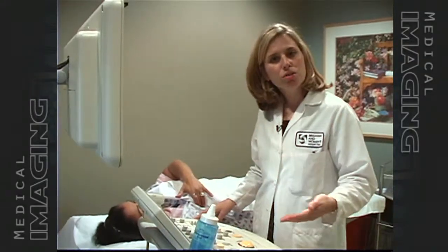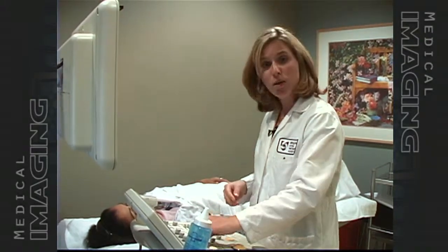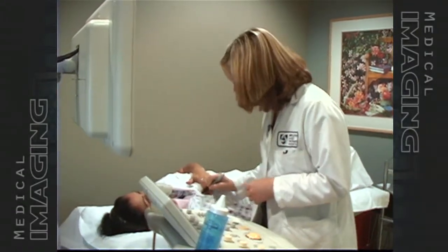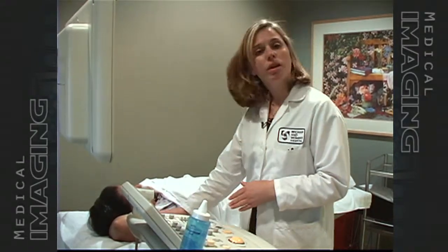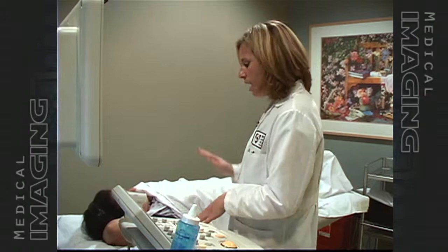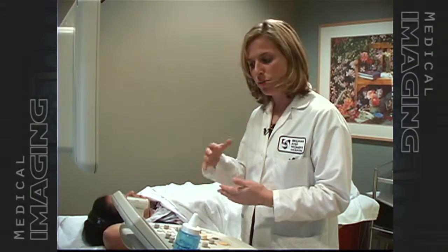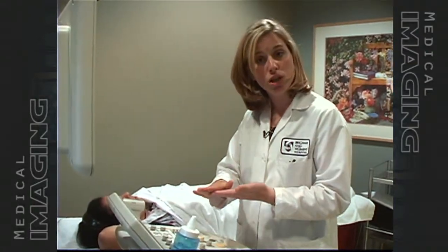The first thing we do to evaluate a lump is we have the patient show us where they're feeling the lump, or where their doctor felt the lump. Then we mark that area on the patient right where they indicated it was. Patient positioning is very important — typically, we have the patient put their arm above their head, and we have the patient roll away from the side we're examining to flatten out the breast tissue, so we can get a better examination all the way through the breast tissue to the chest wall.